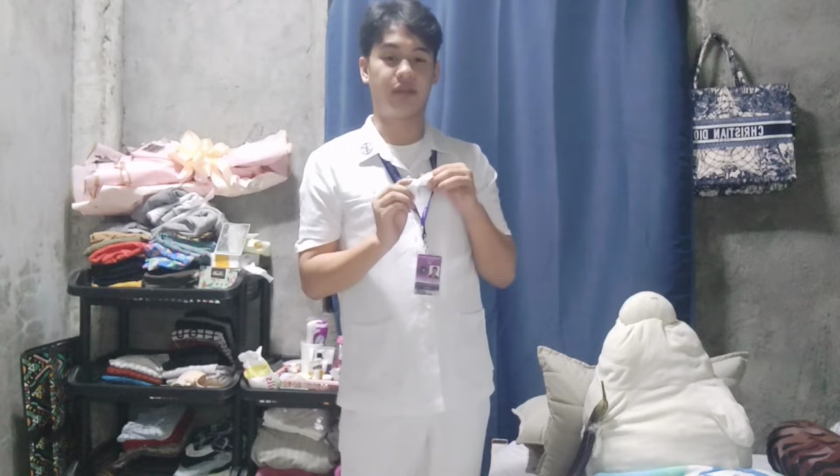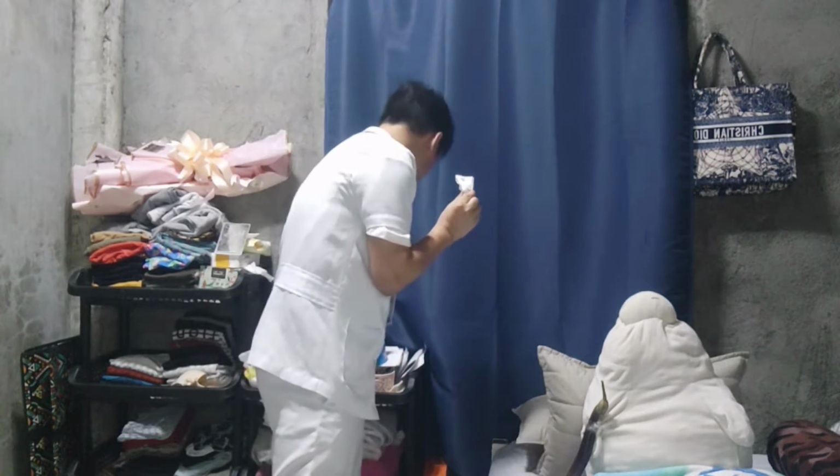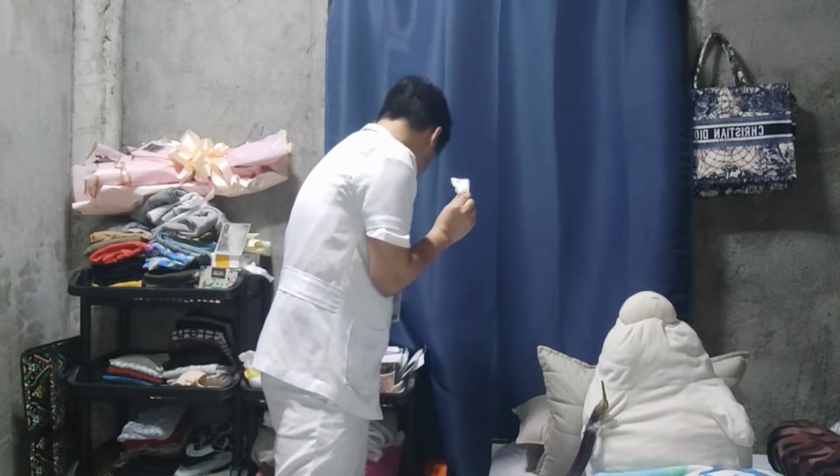We've already broken the ampule by placing the antiseptic packet over the top of the ampule and breaking it from the top. This is the rationale for breaking it that way, for any form of breakage. Then we need to dispose of this top of the ampule in the sharps container. This is to avoid injury to others, or to being pricked by it.